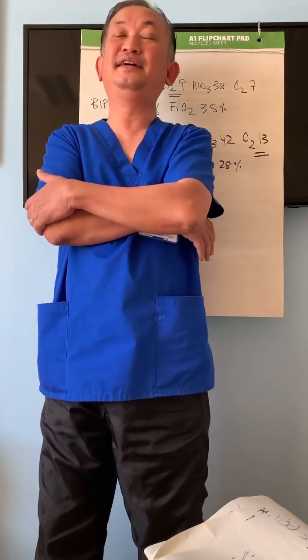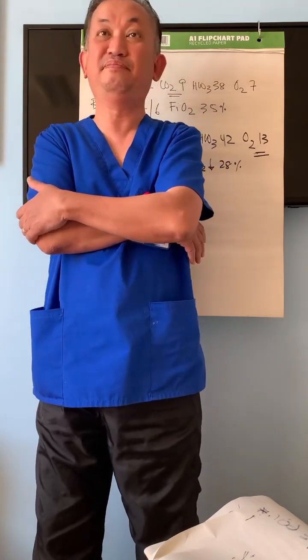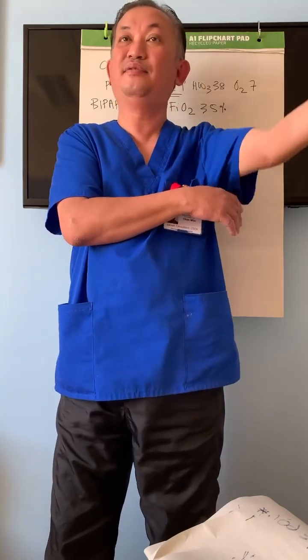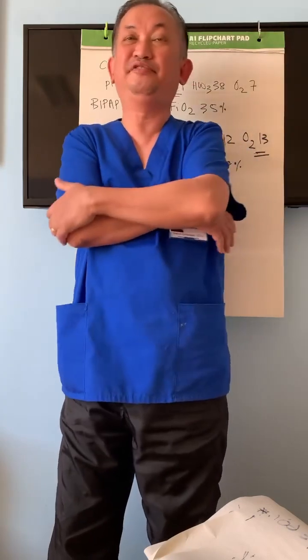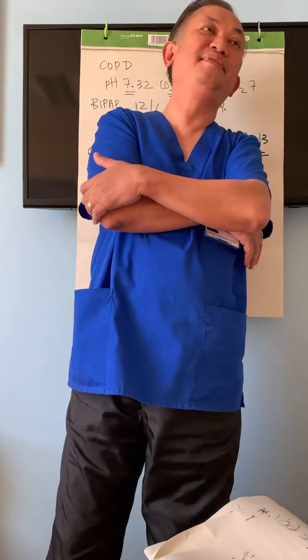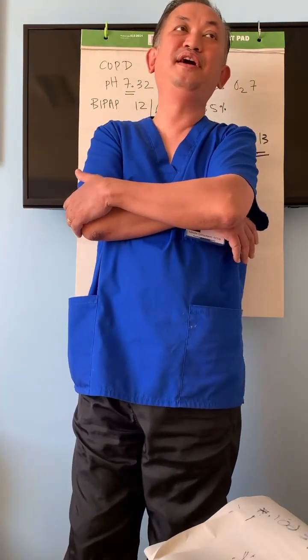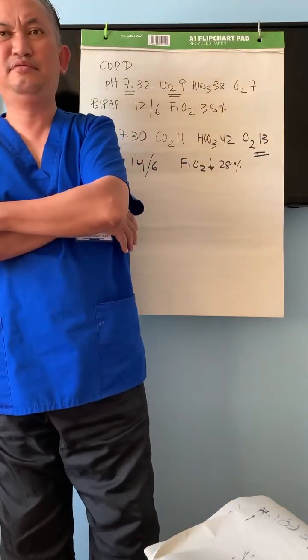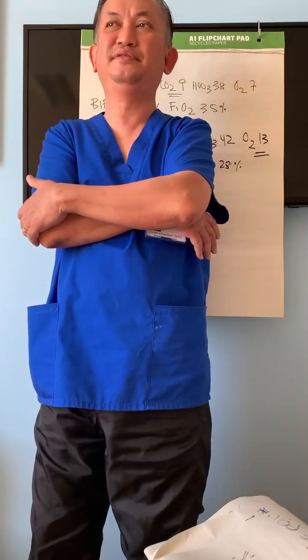In the accelerating phase of injury, not yet at the plateau, and likely to deteriorate further over the next hours, CPAP is better. But you can use HFNO as a step down when they're getting better. Since studying it in mid last year, we prefer to use CPAP earlier, rather than wasting time on HFNO.